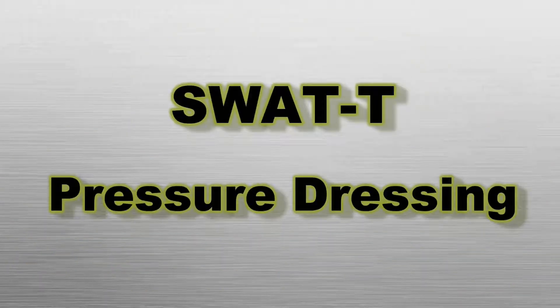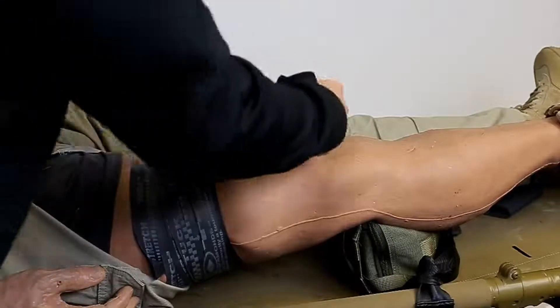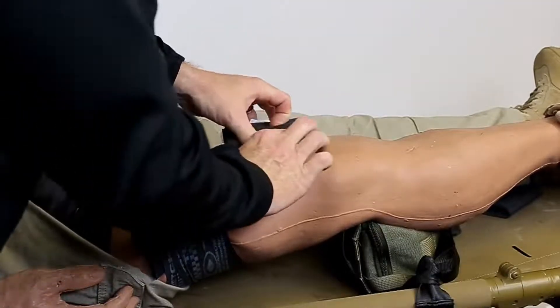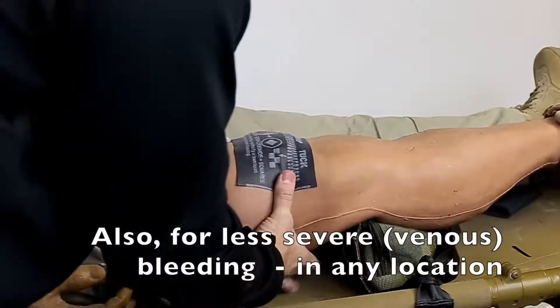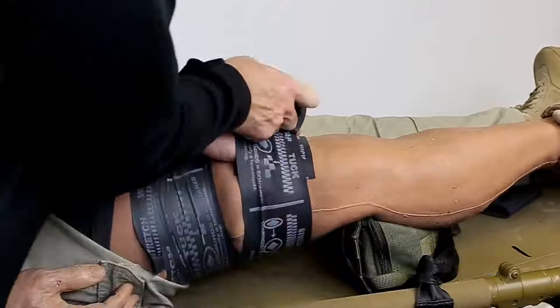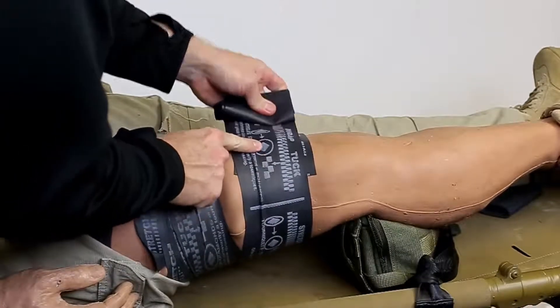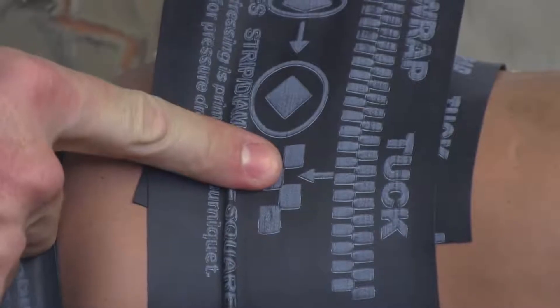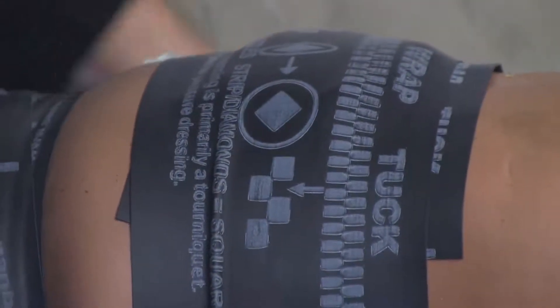Pressure dressing. Some wounds, such as those high on the arm or leg or in the groin, are not amenable to tourniquet placement. These wounds should be treated by packing with a hemostatic agent or gauze and then utilizing the SWAT-T as a pressure dressing. The purpose in this instance is to apply pressure to the packing material and to protect the wound from further contamination. Be aware of how tightly you wrap the SWAT-T and check the pressure indicator markings.